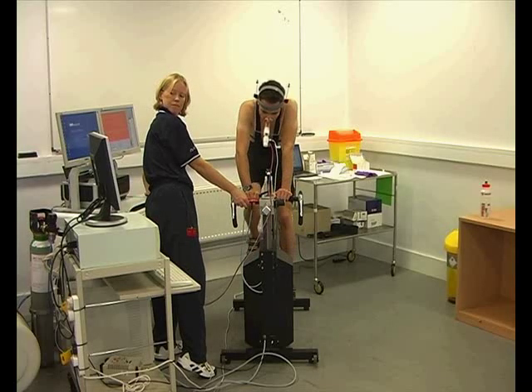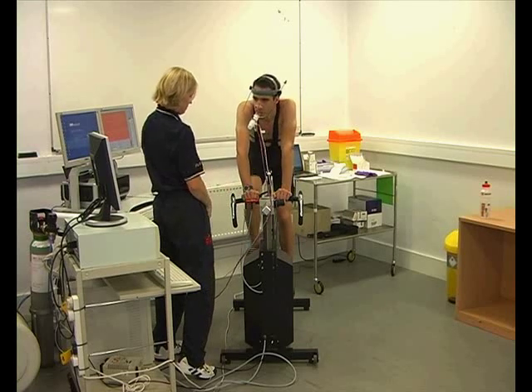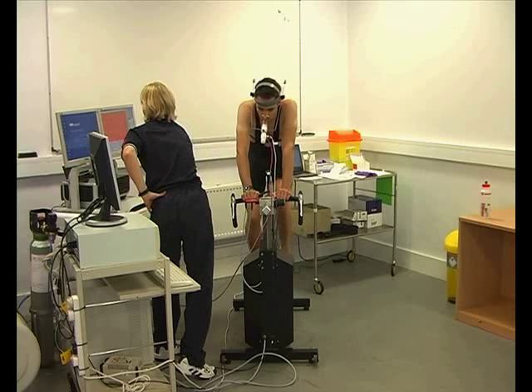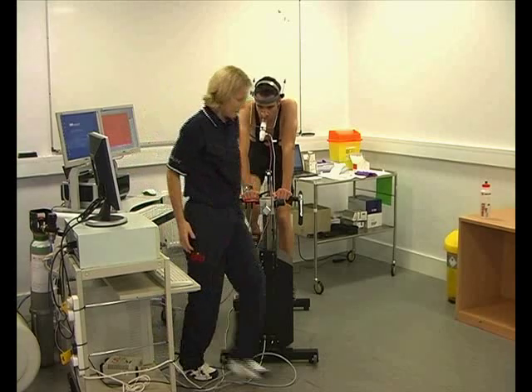As the test gets going, we start the SRM. And we can see it takes a little bit of time for the athlete to overcome the resistance of the flywheel. Quick check that all the equipment is working, the oxygen uptake measurements are coming through, and away we go.